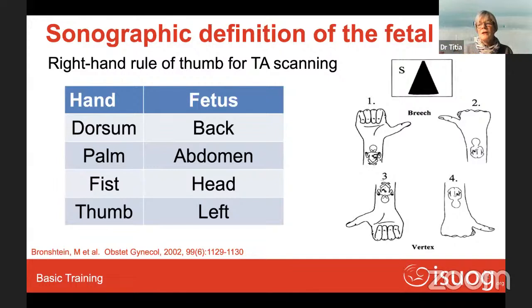Because if you want to look at kidneys, for instance, and one kidney is abnormal, and you think, was this the right or the left kidney? Just slide upwards and see, oh, the stomach is on that side. So I'm dealing with the right side, or I'm dealing with the left side. And it's much easier. If you see something on a leg that you think is abnormal, and you forgot, the baby has moved around all the time, is it now the right or the left leg? Well, you move upwards and you see where the stomach is, and you know the situs immediately, so you can identify if you're dealing with the left or the right side. I have found this extremely valuable during my career, and I think everybody should do it. It's not only me, many other experienced people do this.